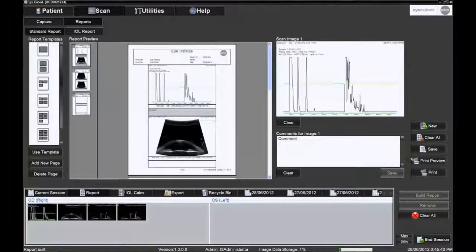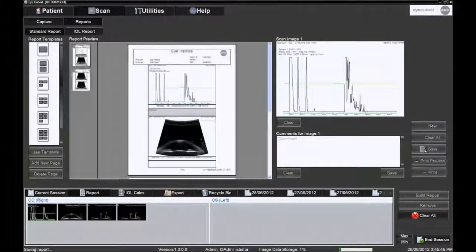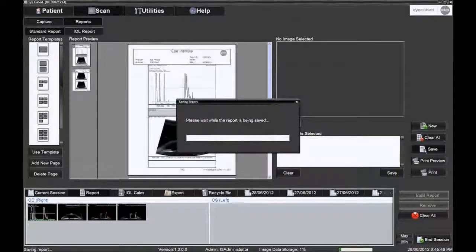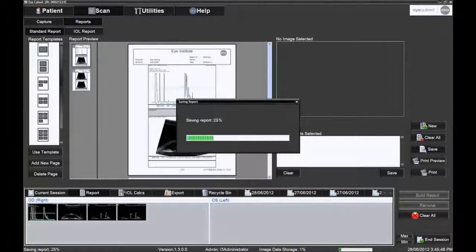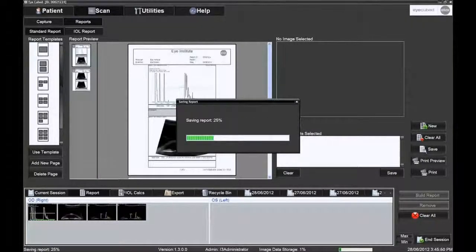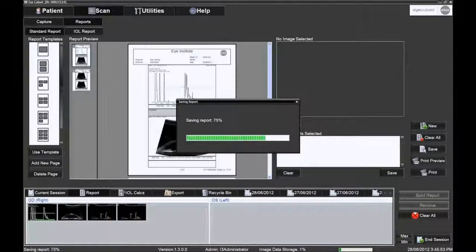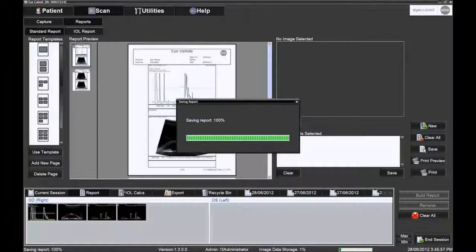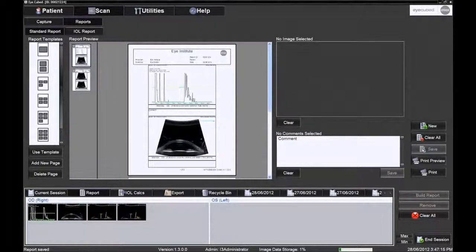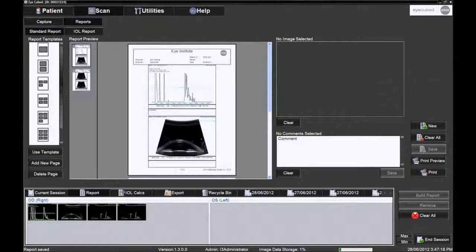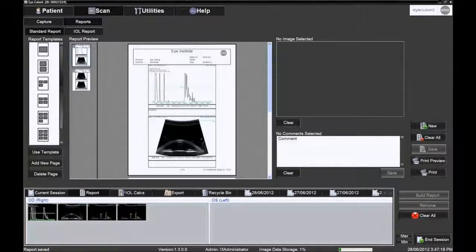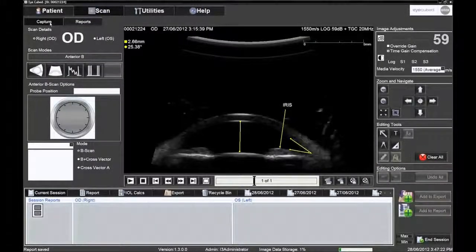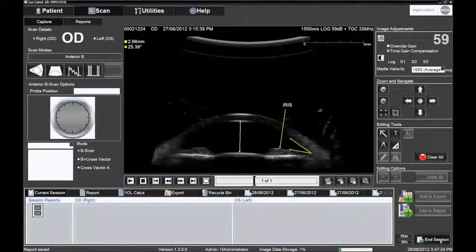The reports can then be printed or saved for future use. The print and save icons can be seen on the right-hand side of the page. The user can now continue to scan by clicking the Capture tab or end the session by clicking the End Session icon.